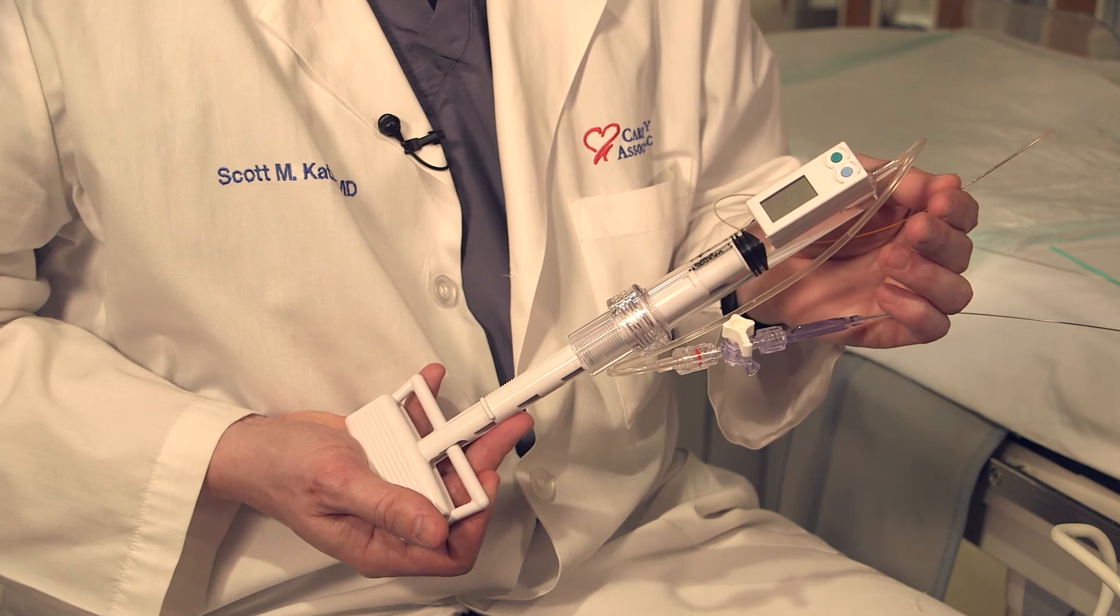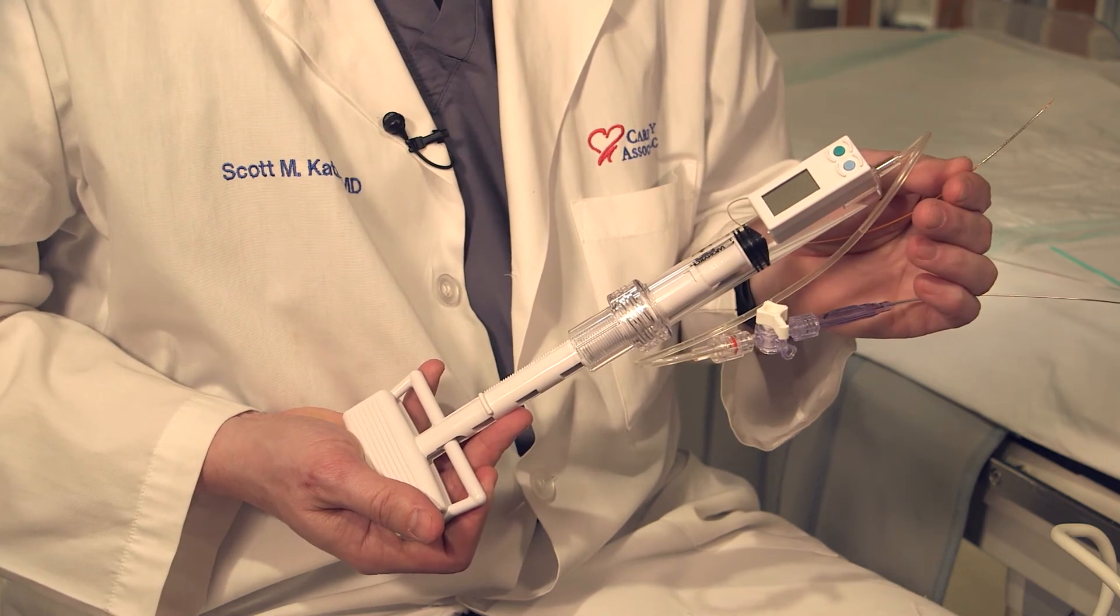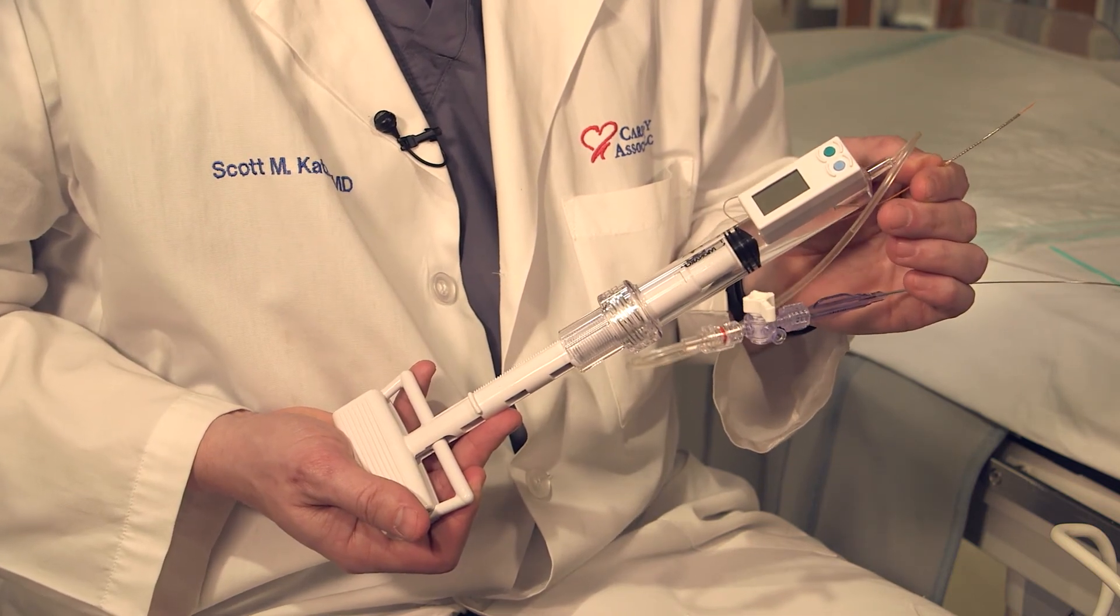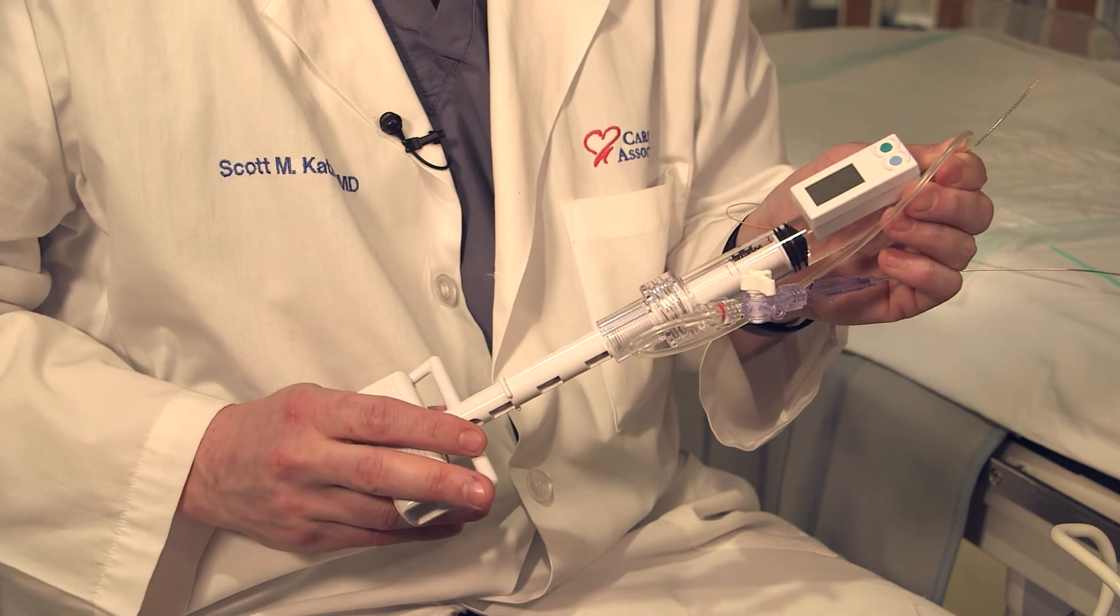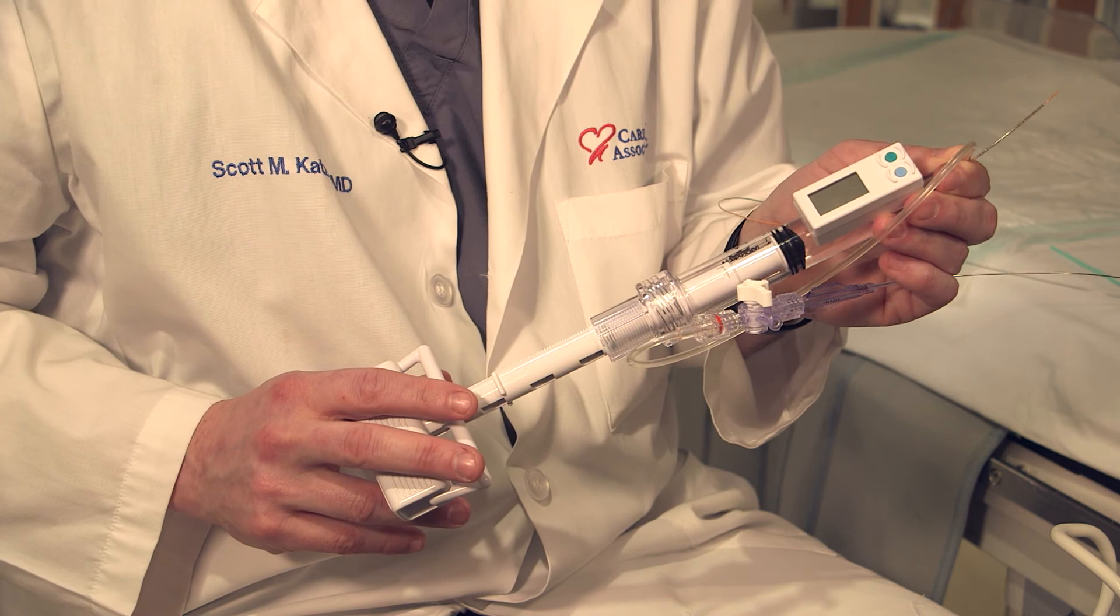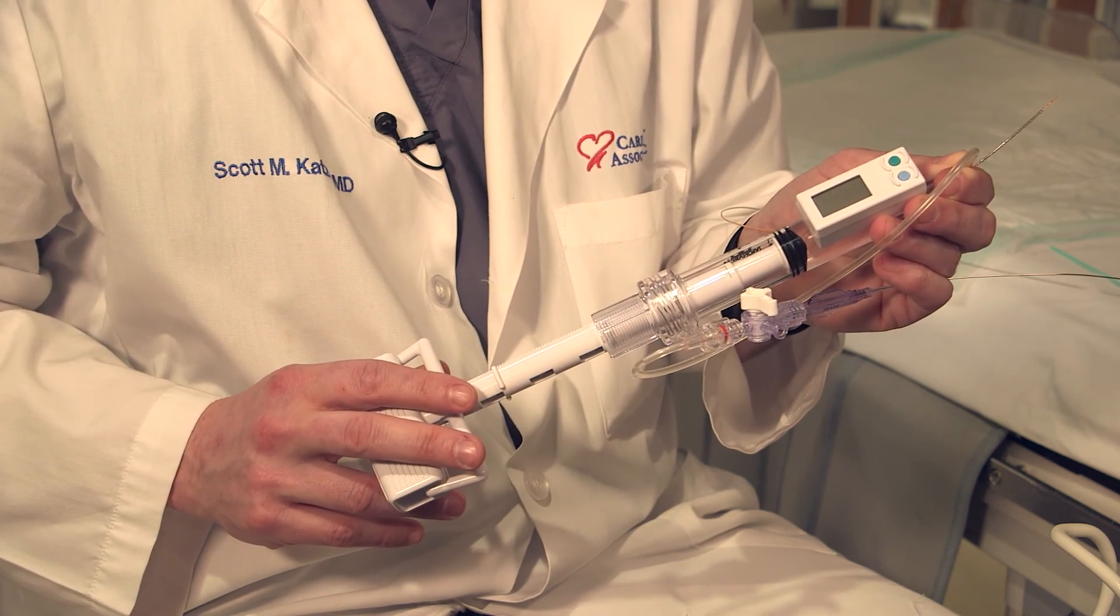This device is one of our balloon inflators. Basically, this gets hooked onto the end of the stent balloon, and we are able to twist this and inflate the balloon to whatever pressure we would like. That's how we expand the stents and place them into the blocked artery to relieve that obstruction.